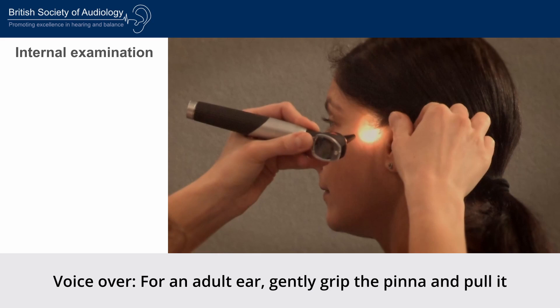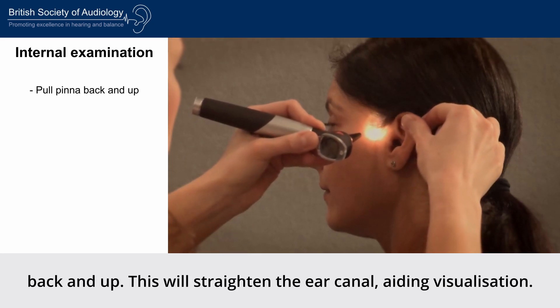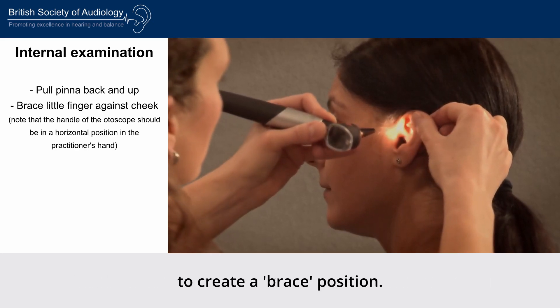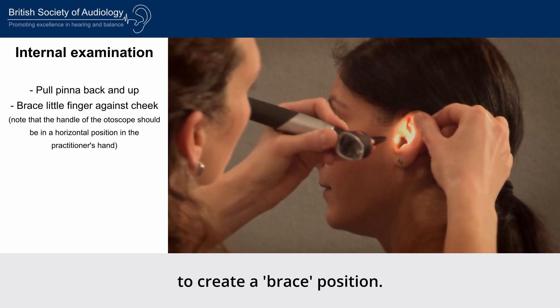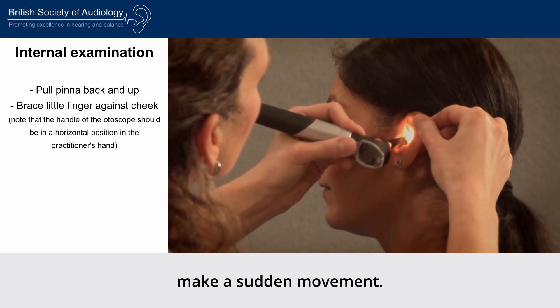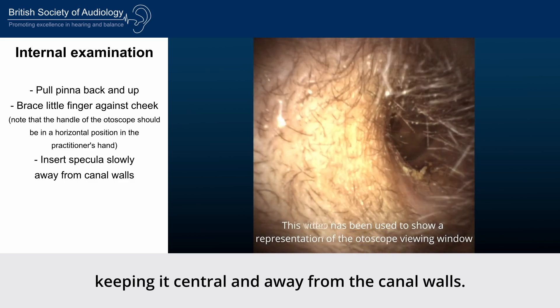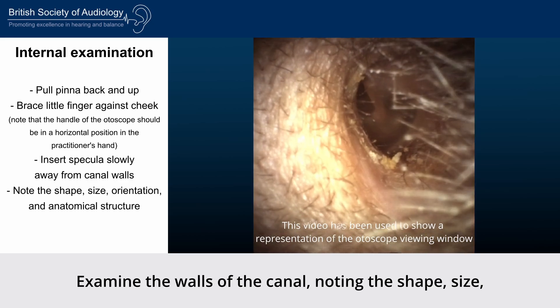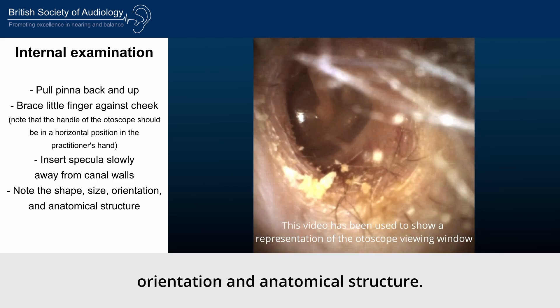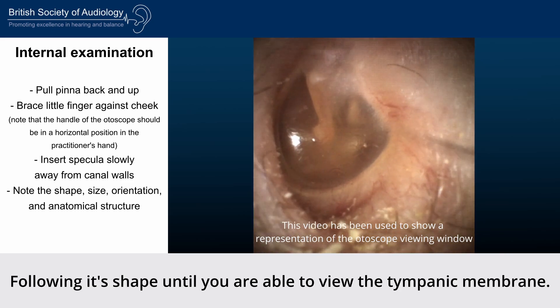For an adult ear, gently grip the pinna and pull it back and up to straighten the ear canal, aiding visualisation. The little finger should rest across the patient's cheek to create a brace position, helping to prevent any injury should the patient make a sudden movement. Slowly insert the clean speculum into the ear canal, keeping it central and away from the canal walls. Examine the walls of the canal noting the shape, size, orientation and anatomical structure.